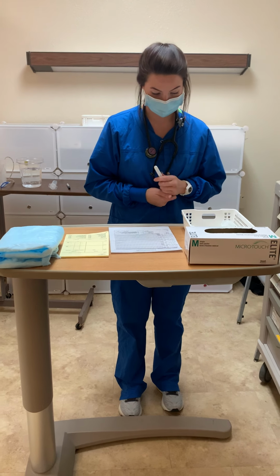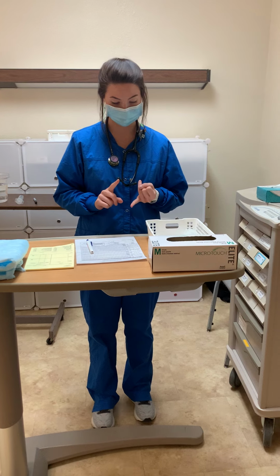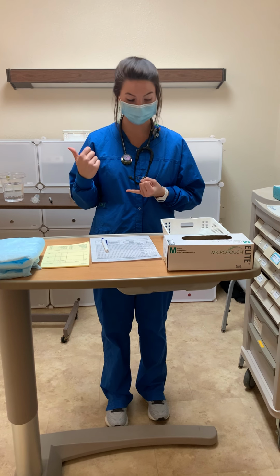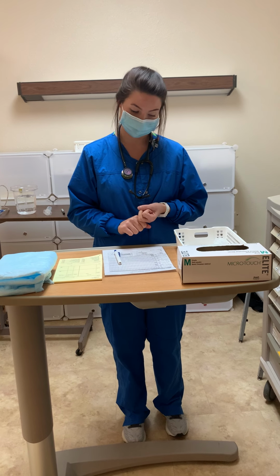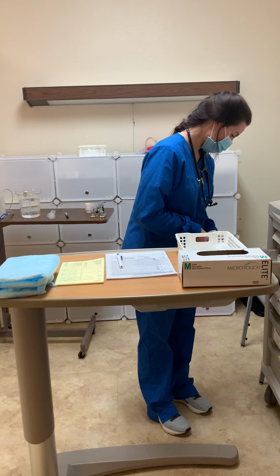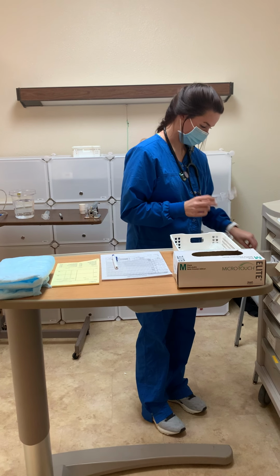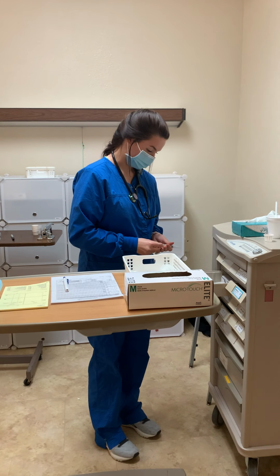meds. So it looks like she's going to be getting a few different medications, but we're just going to start off with first doing her Jevity, which is her continuous feeding, and her Lovenox 40 milligram sub-Q injection. So I'm just going to get her injection here first. So go into her drawer. They usually come packaged like this, but for the video I'm going to be using our demo one because we cannot put anything into poor Joanne.